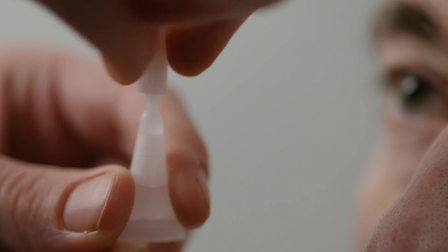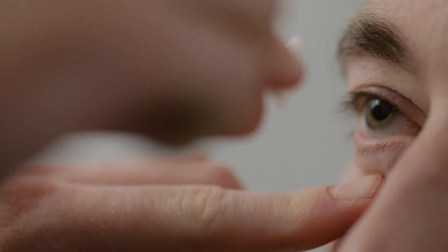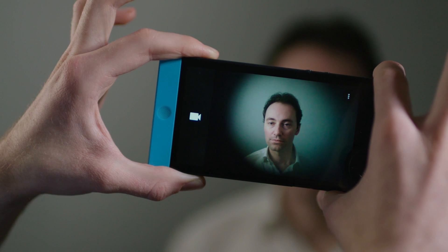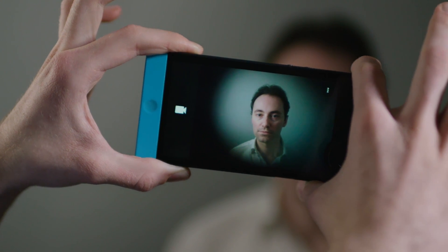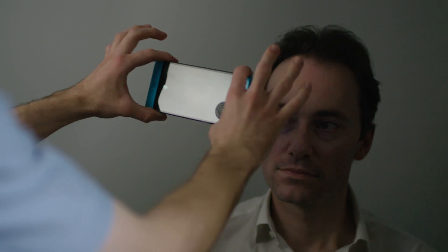Dilate the eye of the patient with eye drops before use. Hold the phone level using both hands to keep it steady. The camera can be set to capture video or photos. Videos and photos will be saved in your usual gallery or photos app.